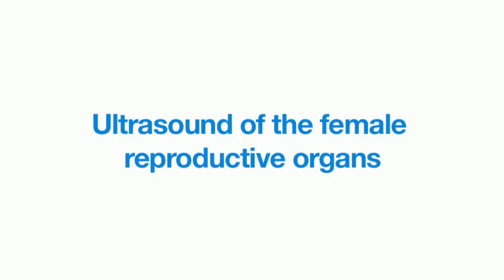This video demonstrates how to set up and perform an ultrasound scan of the female reproductive organs.